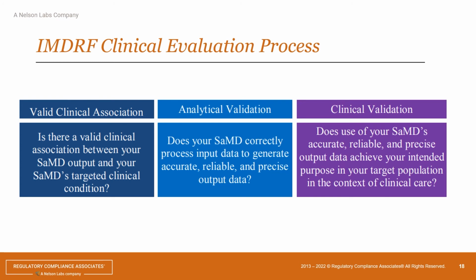Then analytical validation is about your V&V, your design verification and validation and the things that you do. And then the clinical validation, depending on your literature search, on the risk of your device, what category it is, etc. This is where you determine whether you need to do investigations, and how you check and ensure the performance and the safety of your device. That would be through these studies.